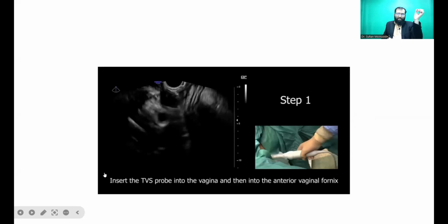Now we see how transvaginal ultrasound is done. I had shown you even yesterday, but for those who are already there, it would be a revision. For those who are not there, for them, this would be a new thing. So look carefully how TVS ultrasound is done.